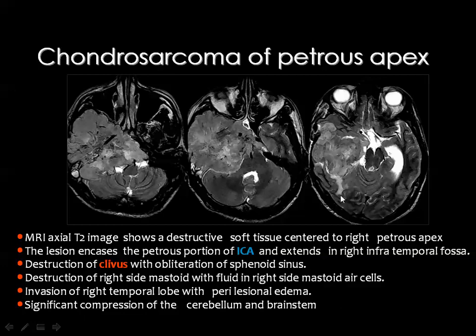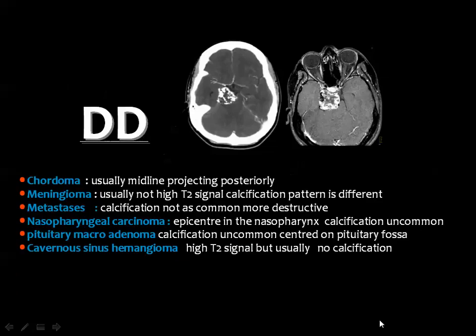And you know that if the tumor is still separated from the brain tissue by meninges, there should not be a brain edema around the tumor. But if the tumor has invaded the brain parenchyma, you will consider some of the reactive brain edema to the tumor.